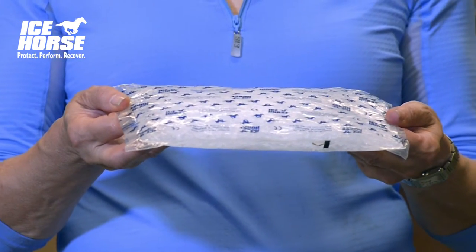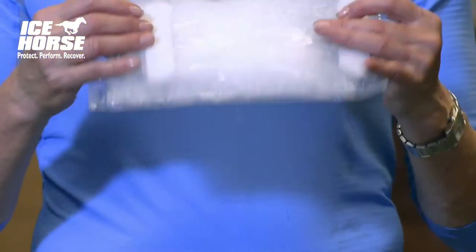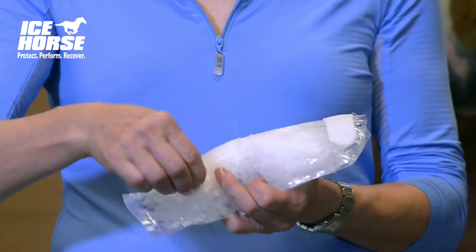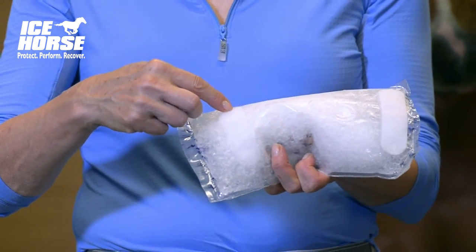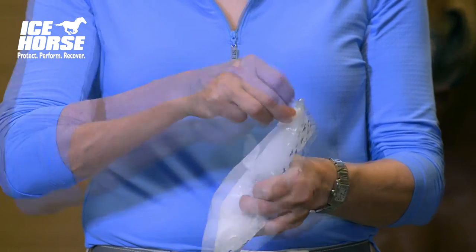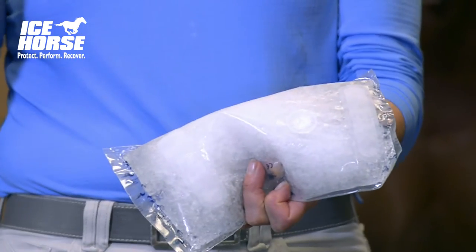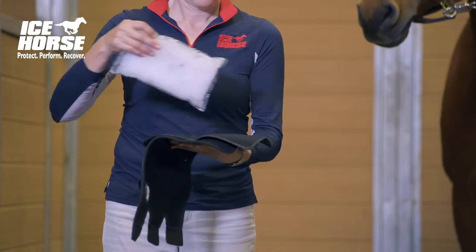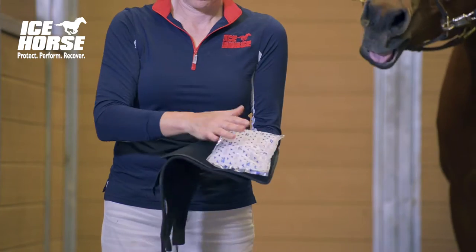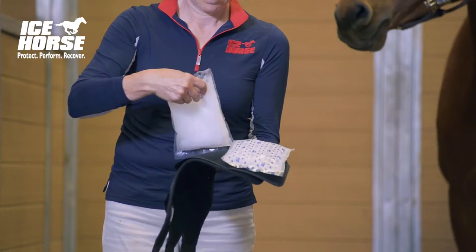When you remove your ice from the freezer, it will look like this. Flip the packs over and remove the covers from the velcro strips so that it will stick properly to the landing pads. When you open up your wrap, you'll see that there's a left and a right. You want to place your ice packs on the landing pads.